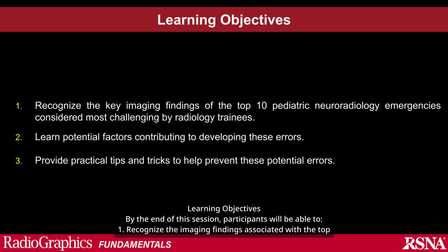Learning objectives: by the end of this session, participants will be able to: 1. Recognize the imaging findings associated with the top 10 diagnostic errors in pediatric neuroradiology emergencies. 2. Understand factors contributing to these errors. 3. Apply practical strategies to minimize diagnostic errors in clinical practice.